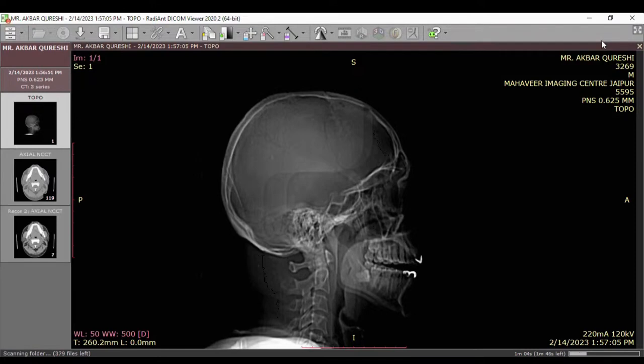Sir, I have a question. For a sphenoid sinus as small as this one, would a medial approach be safer to open the sphenoid sinus? This was a median approach only, but the intersinus septum was far laterally shifted, leaving this sphenoid a small one.